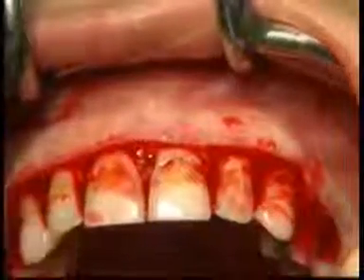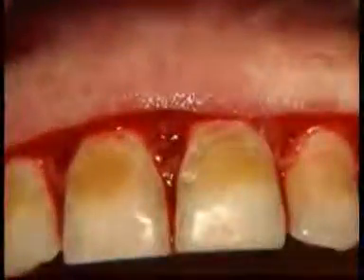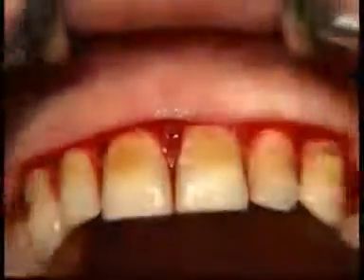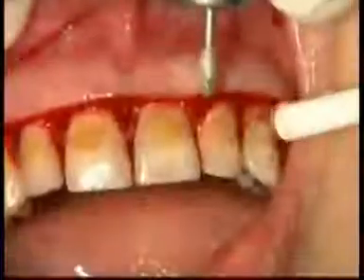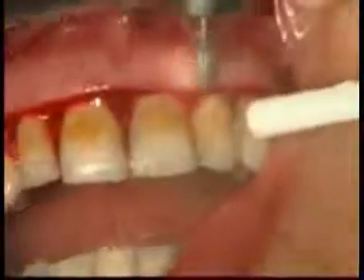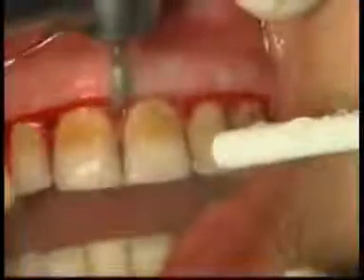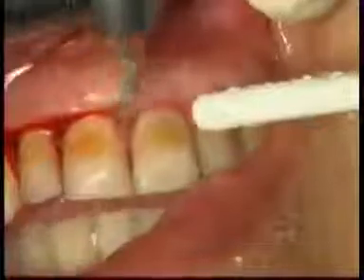At the moment, the gingival architecture is a horizontal step which has little to do with the physiology. Since it is very fibrous tissue, a large grain olive-shaped diamond burr must be used. Initially, this thick keratinized gingiva is modelled by carrying out a bevel. It is basically a sloping plane on the vestibular aspect with all the aspect projected externally, and this is the reason for its name, external bevel gingivectomy.